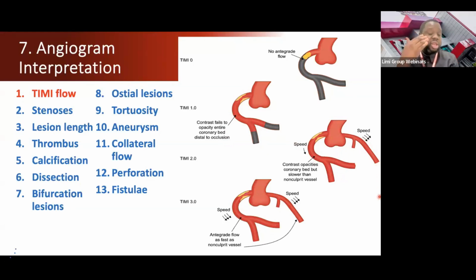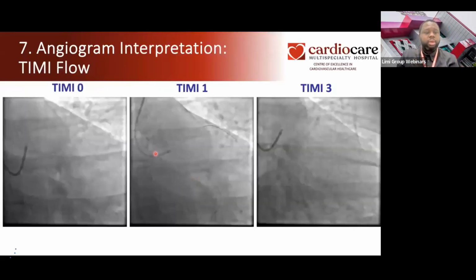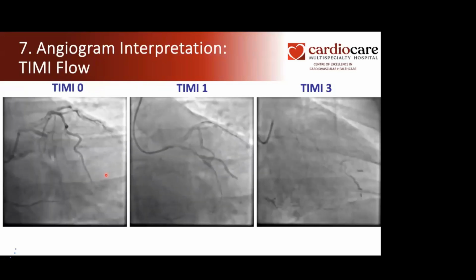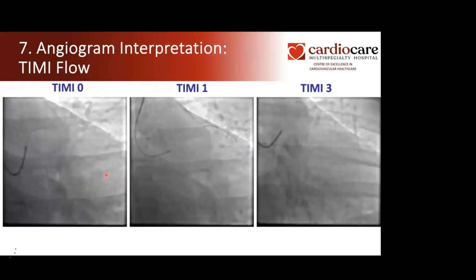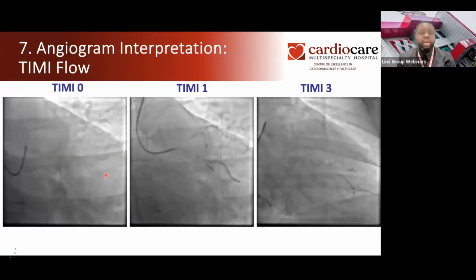So we're able to differentiate these different kinds of flow, and that is very important in grading the occlusion, in prognosticating, and in so many things that we do in cardiology. Sorry, let me give you the example here. Studies have shown that TIMI flow correlates well with the severity of coronary artery disease. Exactly.